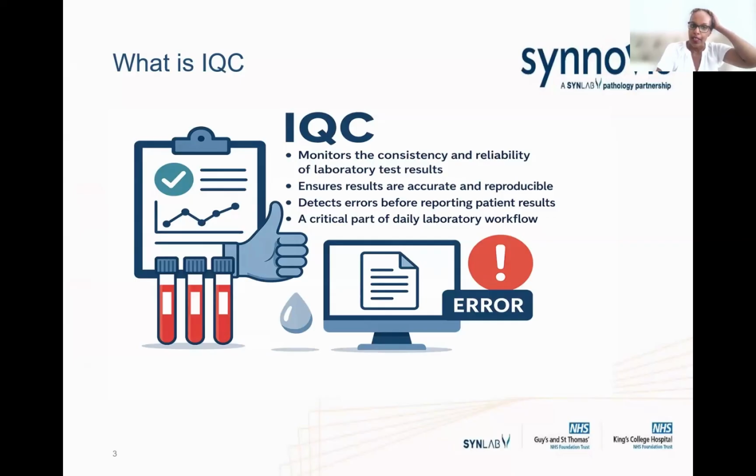So IQC, what is it? It's to monitor consistency and reliability of lab results. It ensures results are accurate and reproducible, and we use it to detect error before it impacts patient results. It's also a critical part of the daily lab workflow. You can't really process any assays or lab tests without running a QC and making sure the quality assurance is robust before running patient samples.